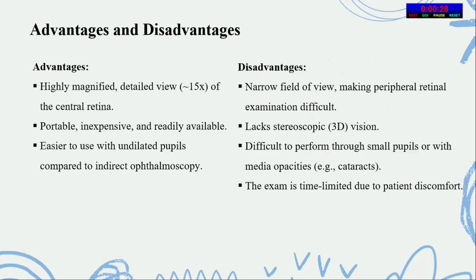As a beginner, we are taught to find a vessel, focus it, trace it nasally to find the optic disc, and two disc diameters from it we have the macula to see the fundus.